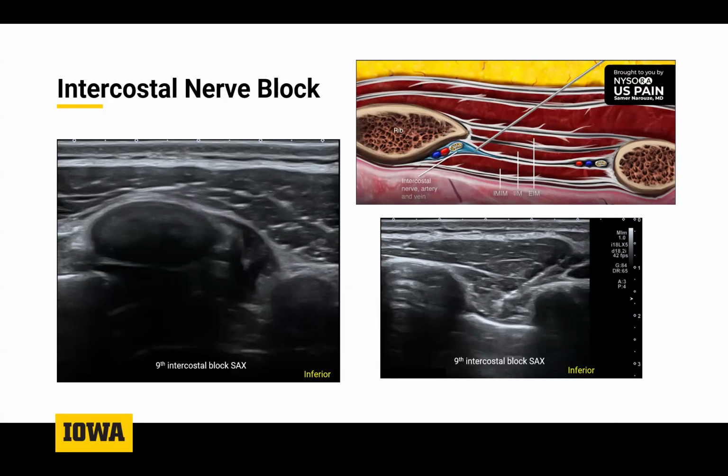But in terms of non-traumatic rib pain, does anybody have any experience seeing abnormalities? Because I rarely see the abnormalities, and we get a referral a couple times a month for this. Yeah, I'm with you, Doug. Traumatic rib stuff is actually kind of fun because we see all these hard findings. They're pretty cool and usually pretty dramatic. Outside of the occasional slipping rib, and the adolescent swimmer that'll come in, it's real hard. I don't see a whole lot here at all. It kind of becomes a frustrating exam, frankly.